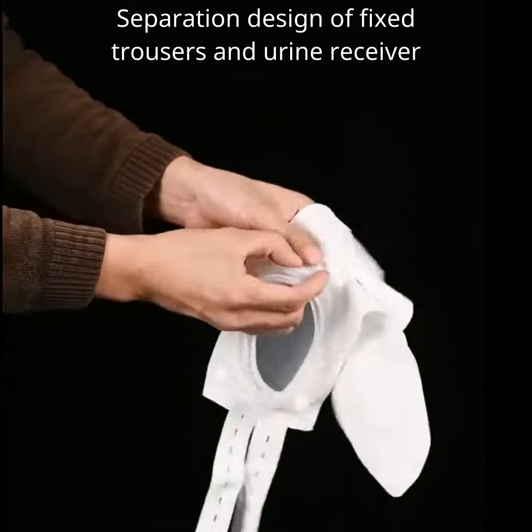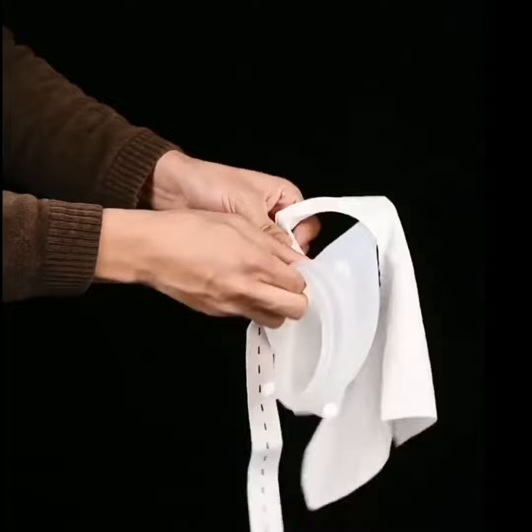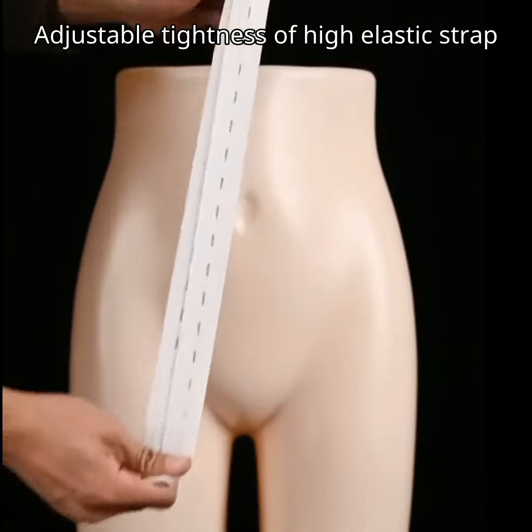Separation design of fixed trousers and urine receiver. Adjustable tightness of high elastic strap.